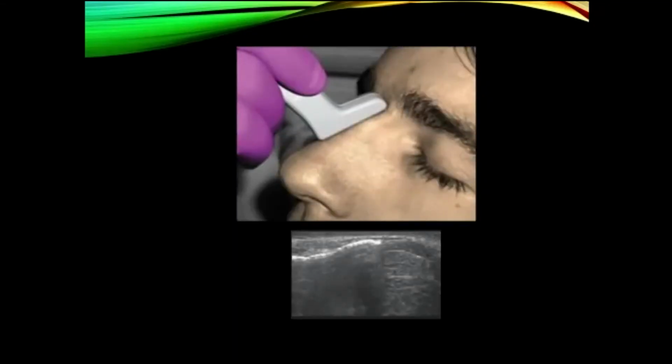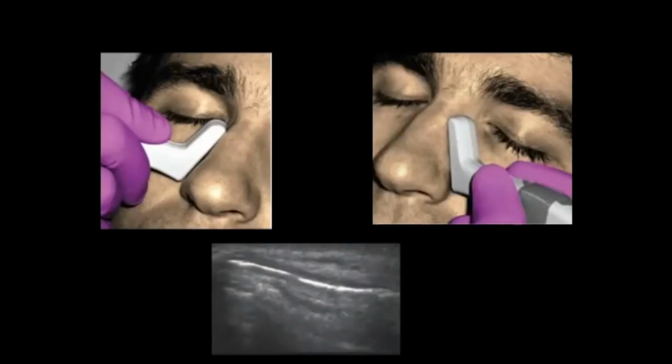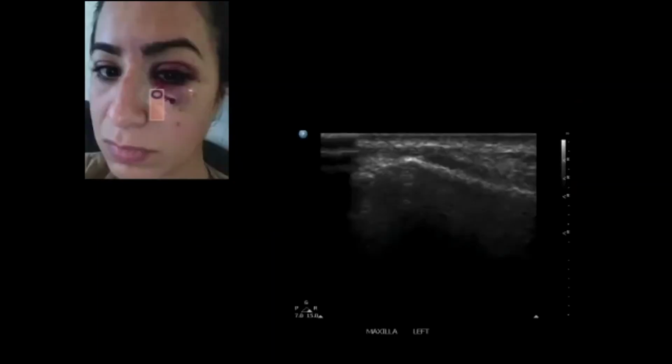To scan these, you might need a hockey stick transducer, so still high frequency, but it's got a smaller footprint, so you can place it right on the bones of interest. So the nasal bone, and again, you have to think about this in reverse, because on the ultrasound image, this is actually proximal and this is distal, so you're getting into the nasal cartilage at the distal aspect of it. And then looking at the nasal bones from either side as well, so you can see anterior and then the two lateral nasal bones. You can also look at the maxilla.